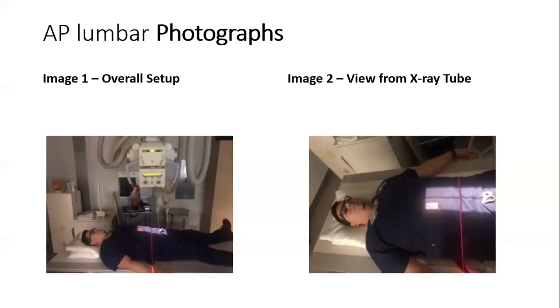The collimation of the field was 17x7. I collimated the anatomy to include the lumbar spine. I placed the marker upon the torso of the patient at his anatomical right to include the marker inside of the image.